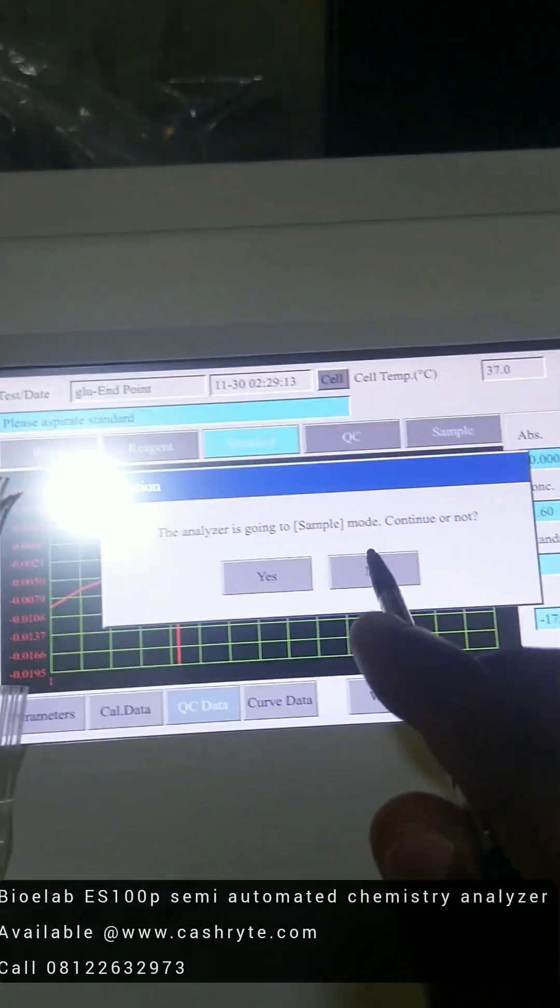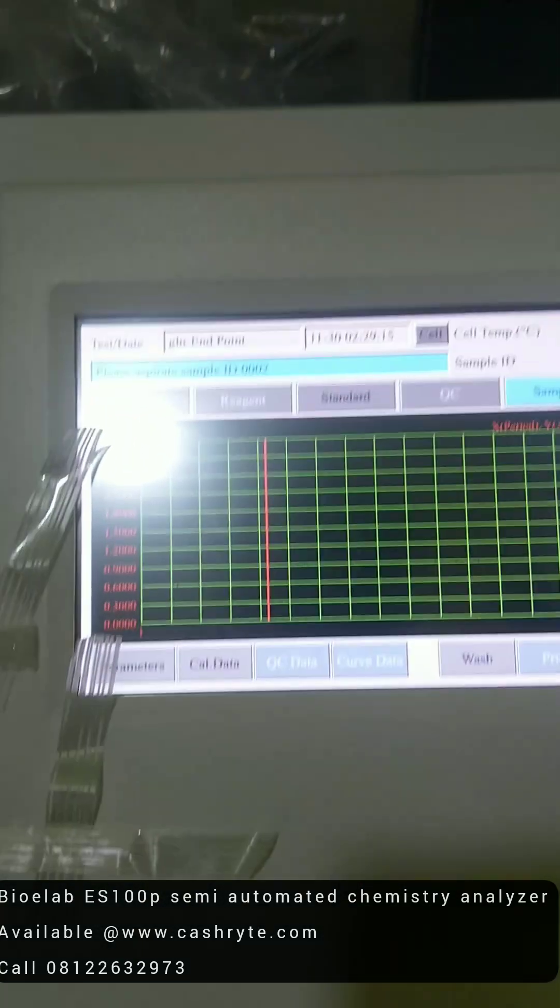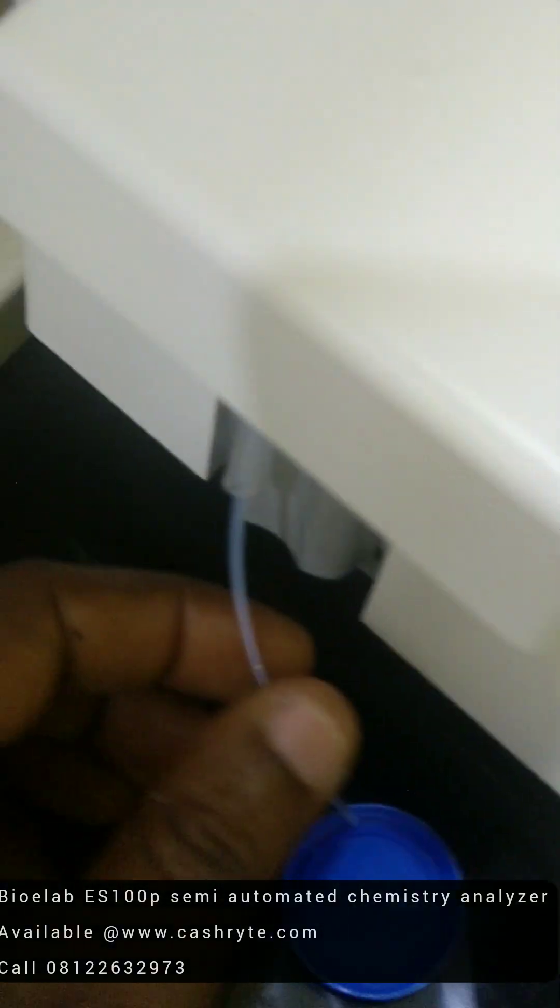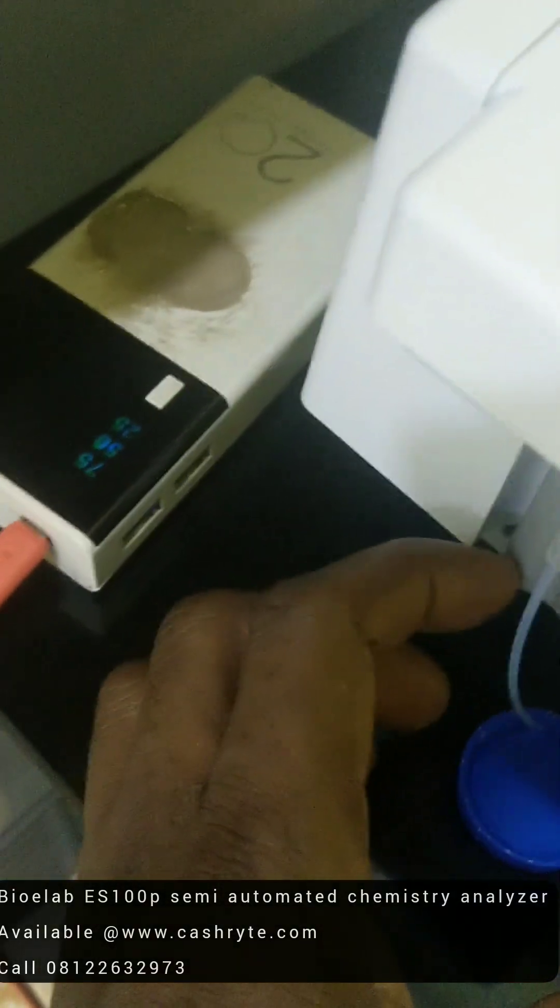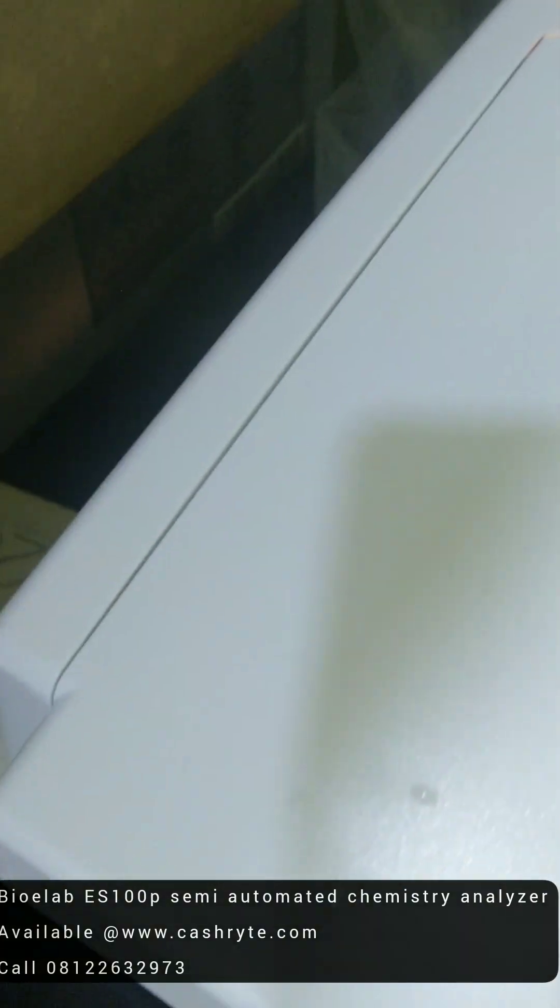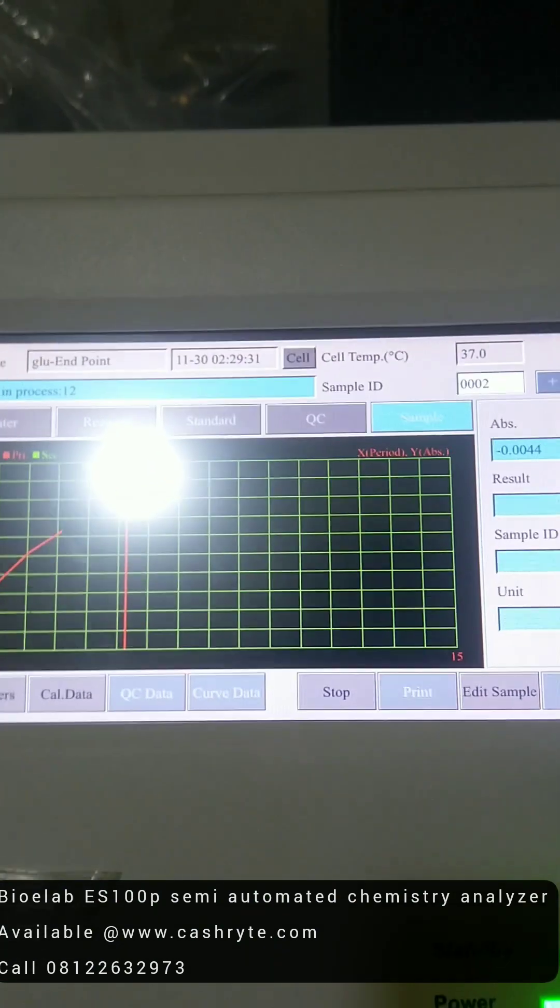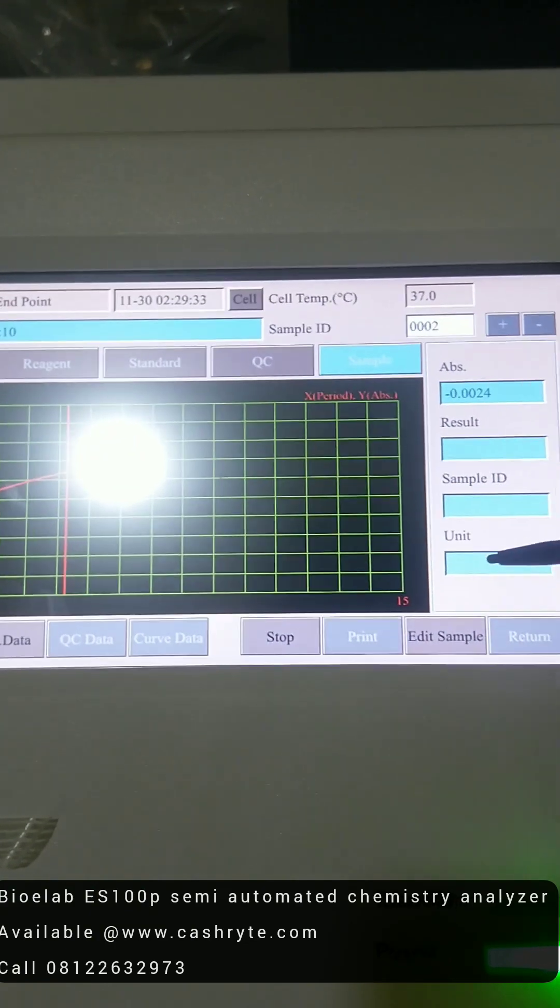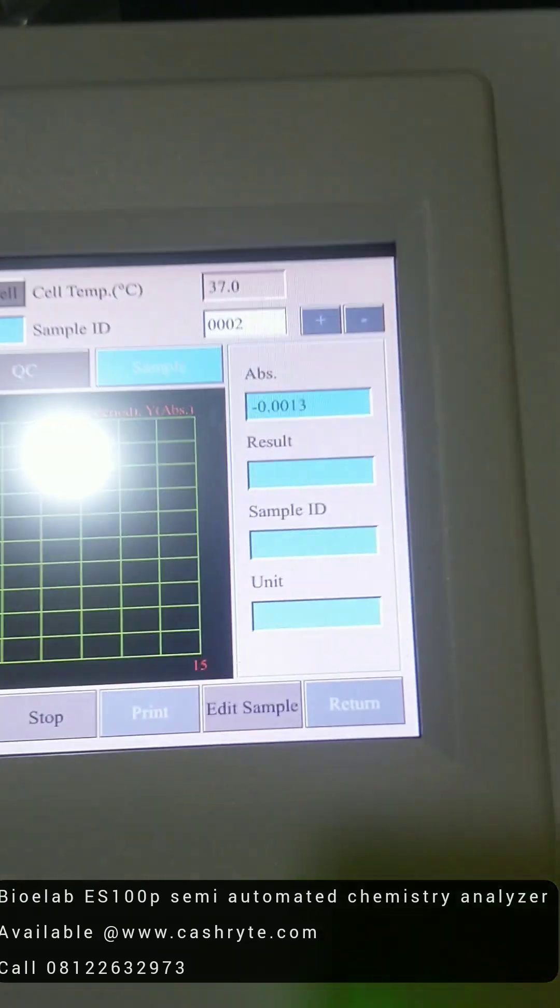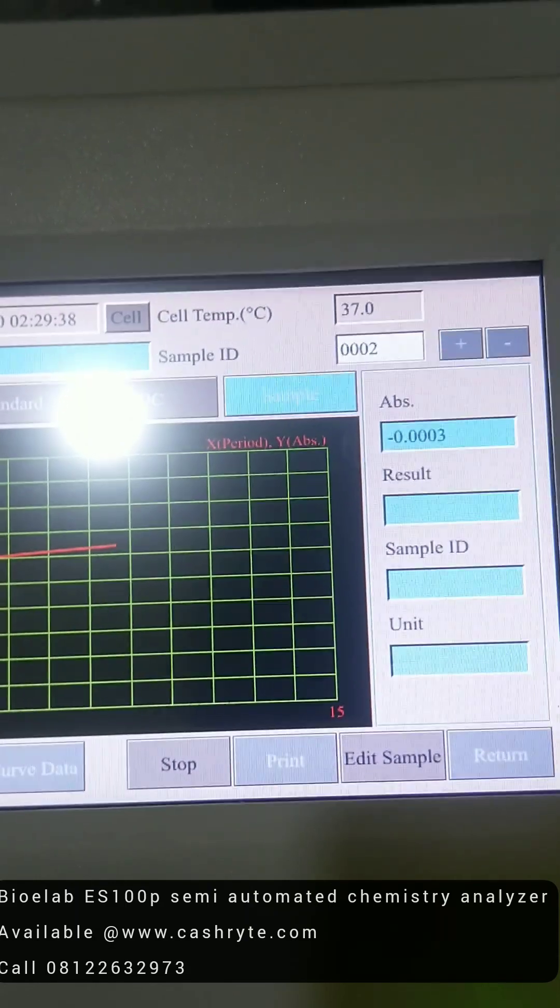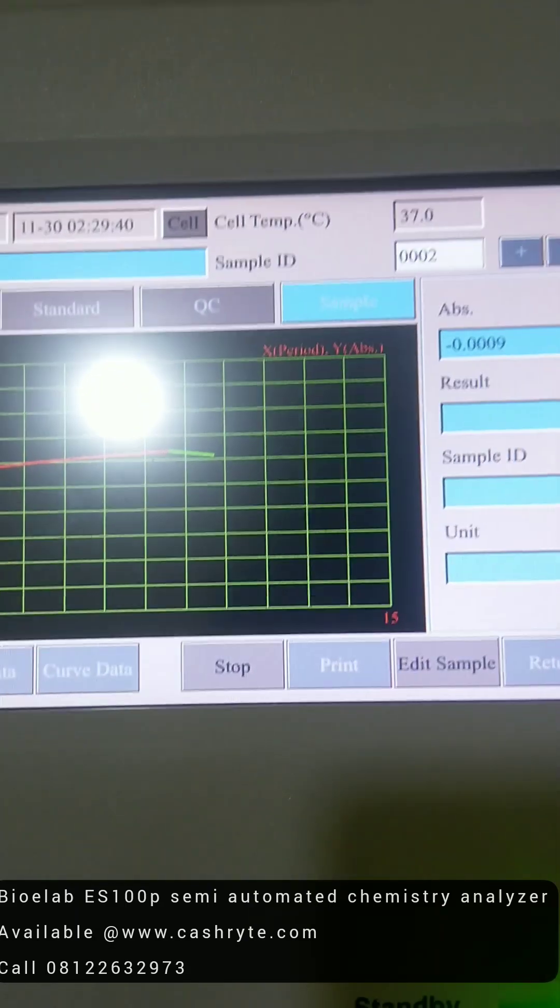The analyzer is going to sample. So you say yes. So if you have your sample, you just aspirate sample, just like that as well. Click on the aspirate button. So it's going to give you your results here. Sample ID and the unit. So this is how simple it is to use this particular machine.